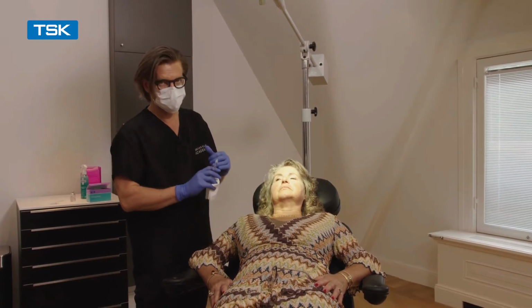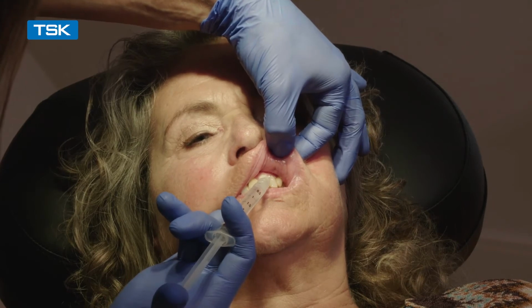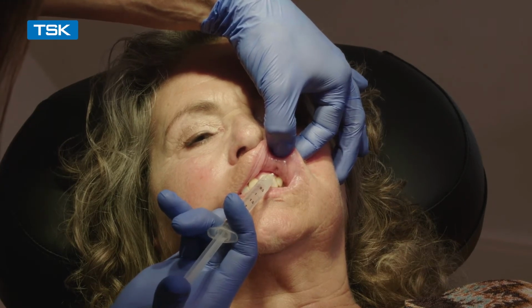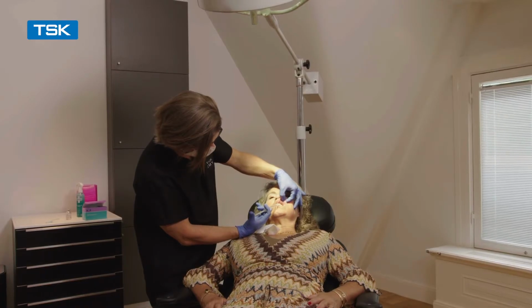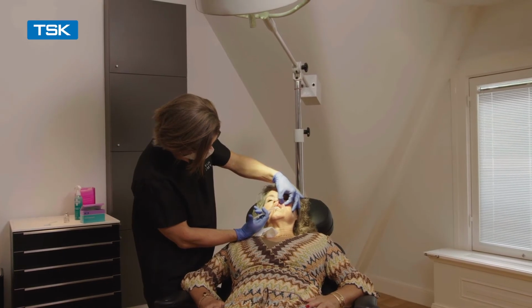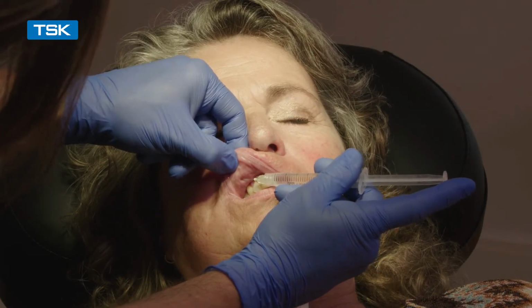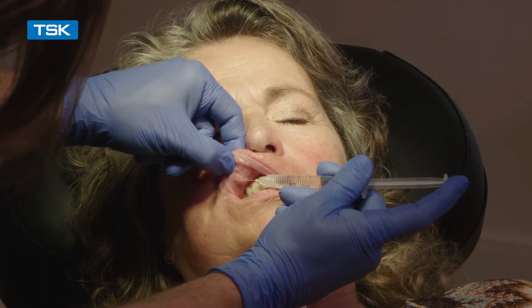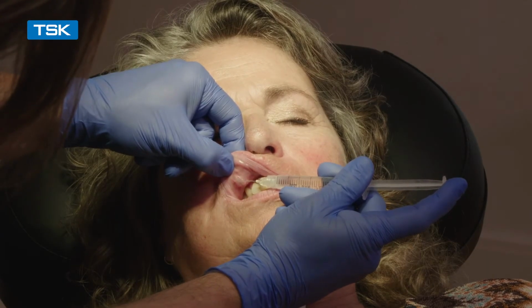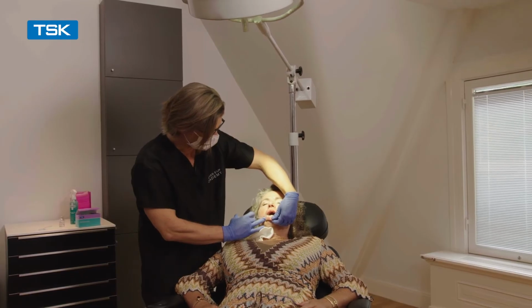The anesthesia with lidocaine is a hybrid field block, dental block. I like to call it the Amsterdam block. Extremely superficial. This is 0.25 mil. Same on the other side, as well as the lower lip.